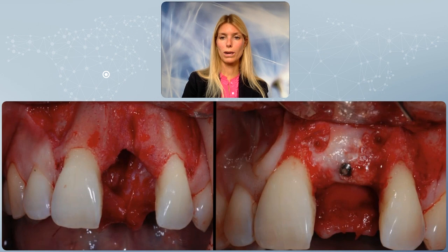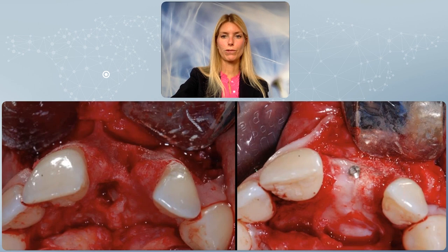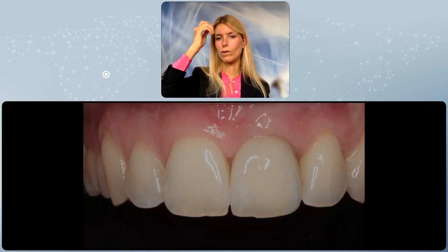Now, we have resolved this case, and we have transformed a quite challenging scenario into a clinical situation where you have enough bone to position your implants in the correct 3D positioning. And you can see the before and after, even from the occlusal point of view. So now we have enough crestal bone to select the position of our implant. So the implant is positioned, and as usual, connective tissue grafts are used to enhance even more the final aesthetic results. You can see the healing and the final restoration on the day of delivery.